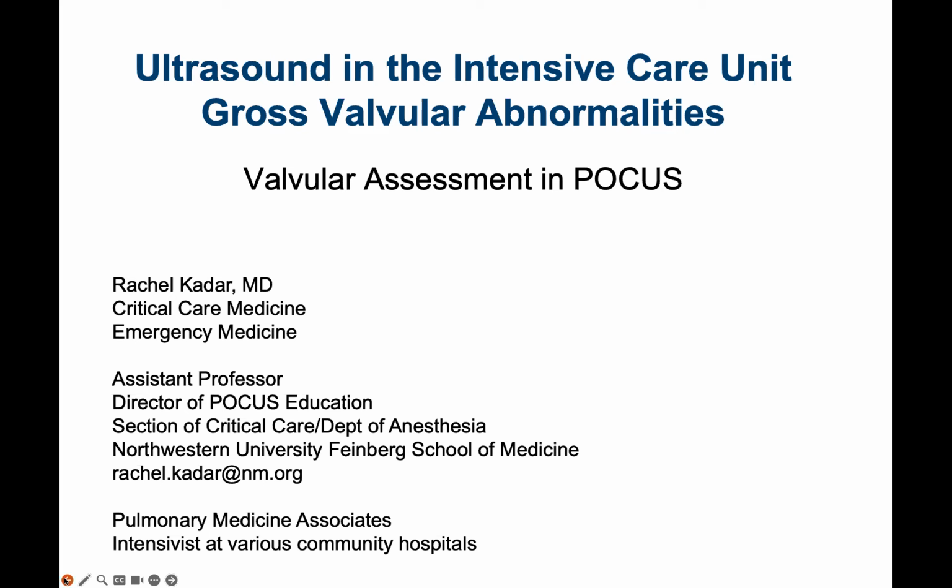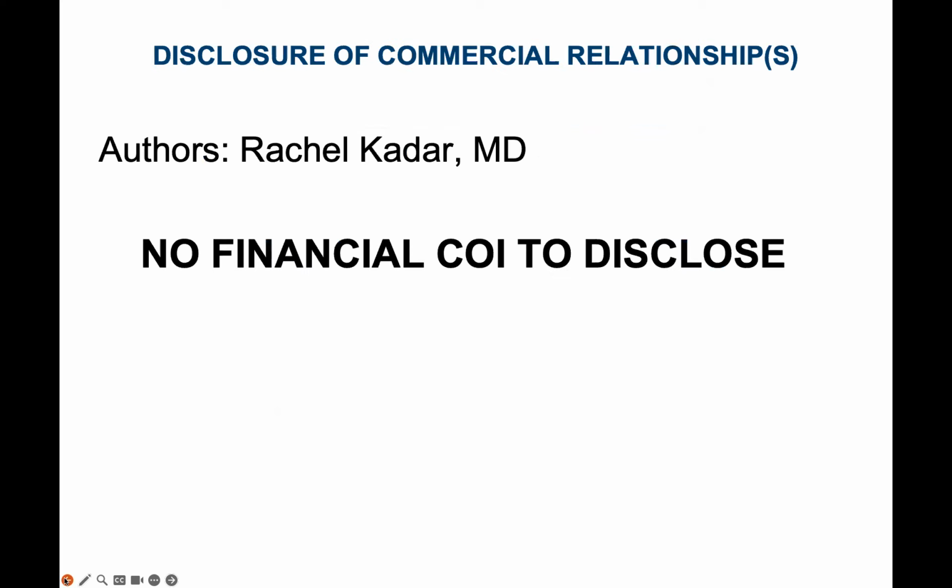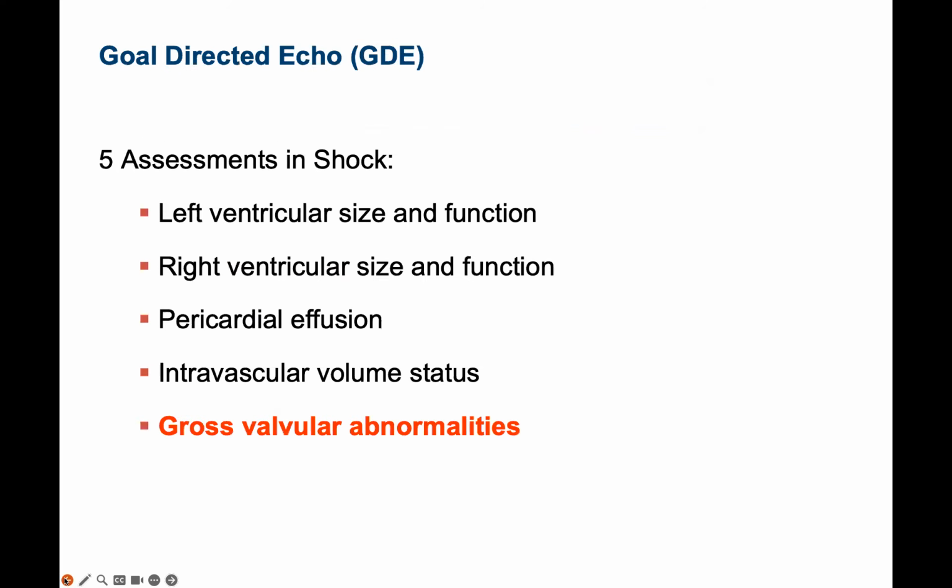So today we're going to talk about ultrasound in the intensive care unit, gross valvular abnormalities. And so today we will do a valvular assessment in point of care ultrasound. I have no financial disclosures.